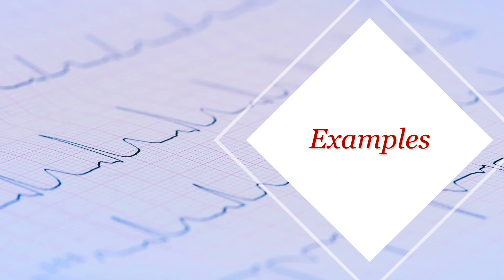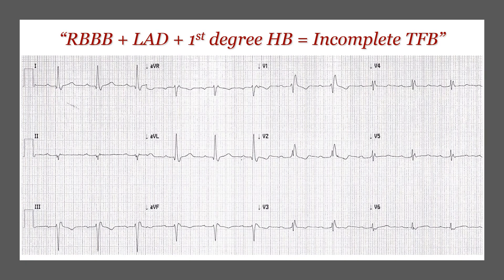Let's look at some examples. In this first ECG, we can clearly see a broad complex with a right bundle branch block pattern. The axis in lead one is pointing up and AVF is pointing down — that is left axis deviation. There is also a prolonged fixed PR interval and only one P wave visible before each complex. So that is a first degree block — this is an incomplete trifascicular block.